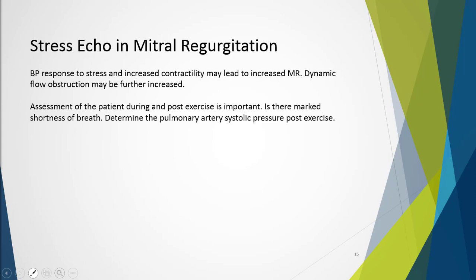We can also use stress echo for mitral regurgitation. Stress echo is useful to evaluate the patient's tolerance to exertion. This may be considered by a surgeon to determine the appropriate time to intervene to repair or replace the valve.